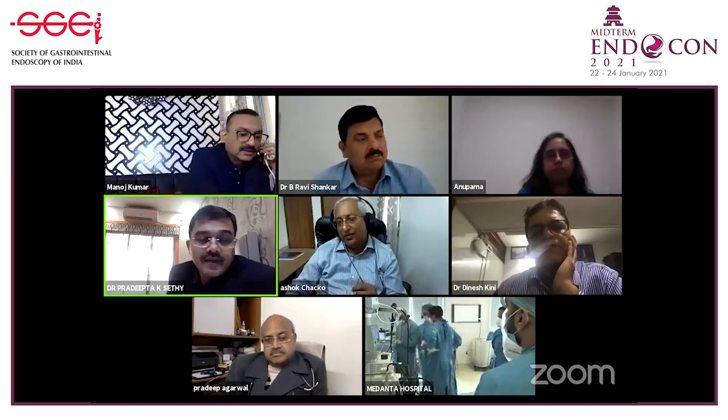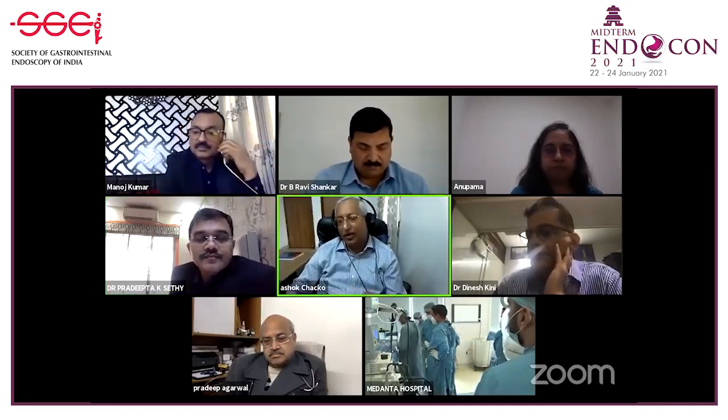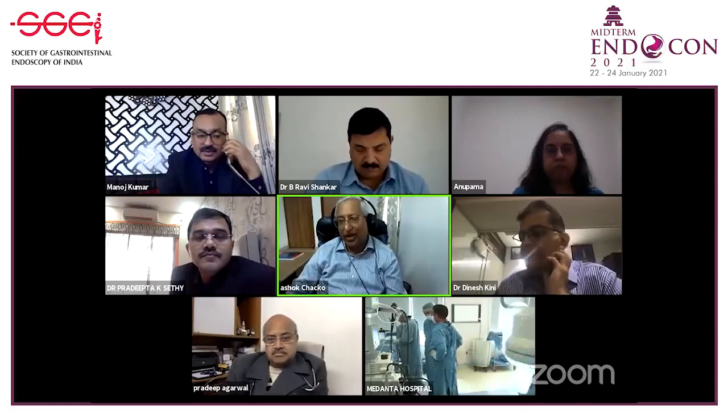Because we do see during the procedure, the capsule is not moving forward. So what do you do? Regarding the first question, your first question was capsule retention, and how do you counsel them, how do you tell them, if there is a capsule stuck, the patient lands up in surgery, and they might not agree for a diagnostic procedure that goes for surgery. So, I mean, if you are doing a patient with Crohn's, and even if you have the slightest doubt, we have to tell the patient and document it.